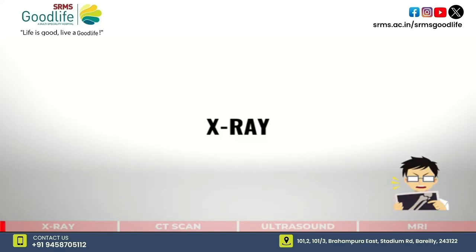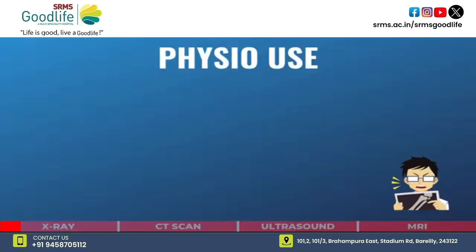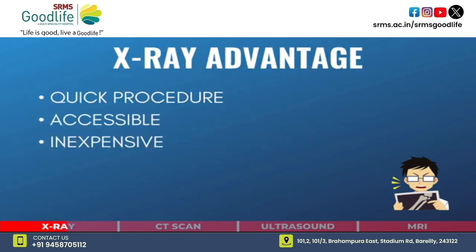X-ray is a form of radiation. It penetrates the body to produce an image. Physiotherapists commonly use X-ray to evaluate a possible fracture, dislocation, and bone infection. X-ray has many benefits. It can be performed quickly, it's readily available and cost-effective.